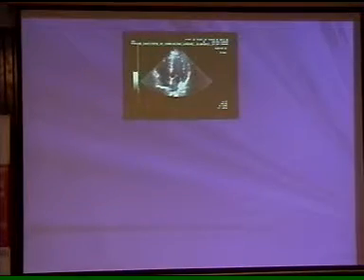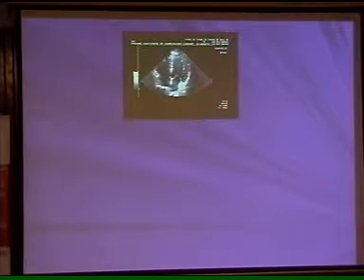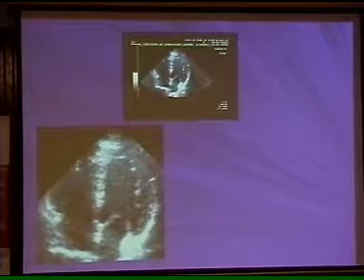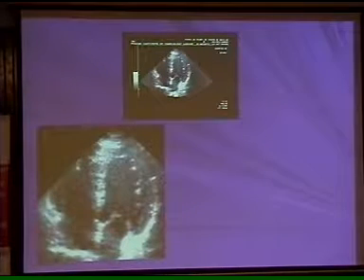So it is giving you false results. So what you do is go on to a modified Simpson's, which is more reliable to date. Though for an operator this is a bit of a cumbersome procedure, obviously it is a good tool to give you a good ejection fraction. You calculate it in systolic and diastolic frames.